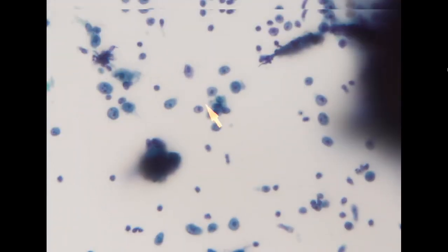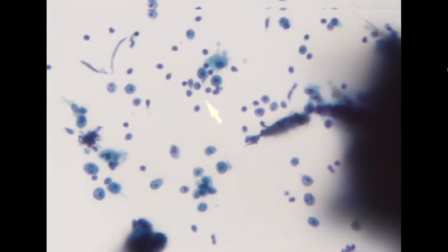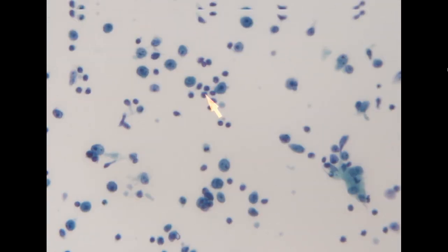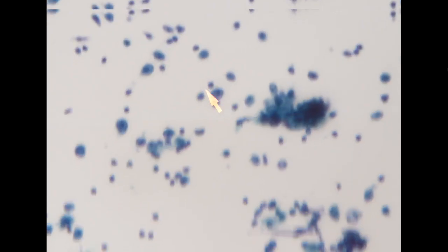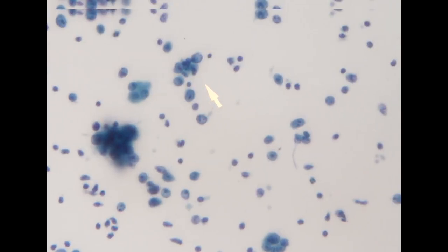So the cytomorphology of these atypical cells, with single prominent nucleoli in the center, looks like immunoblasts. Just based on the cytomorphology, the most likely diagnosis for the case is a diffuse large B-cell lymphoma, post-germinal type, because it shows this immunoblastic type of feature.